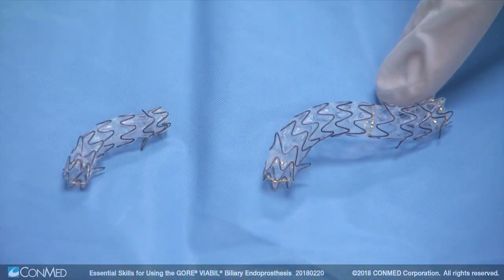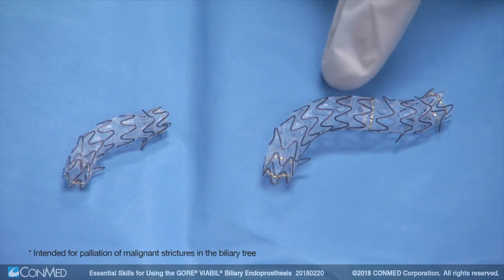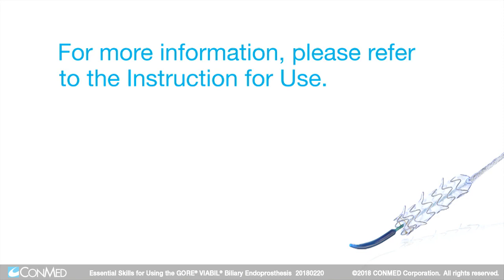The transmural drainage holes permit side branch flow for improved treatment options of hilar strictures. For more information, please consult the instructions for use.